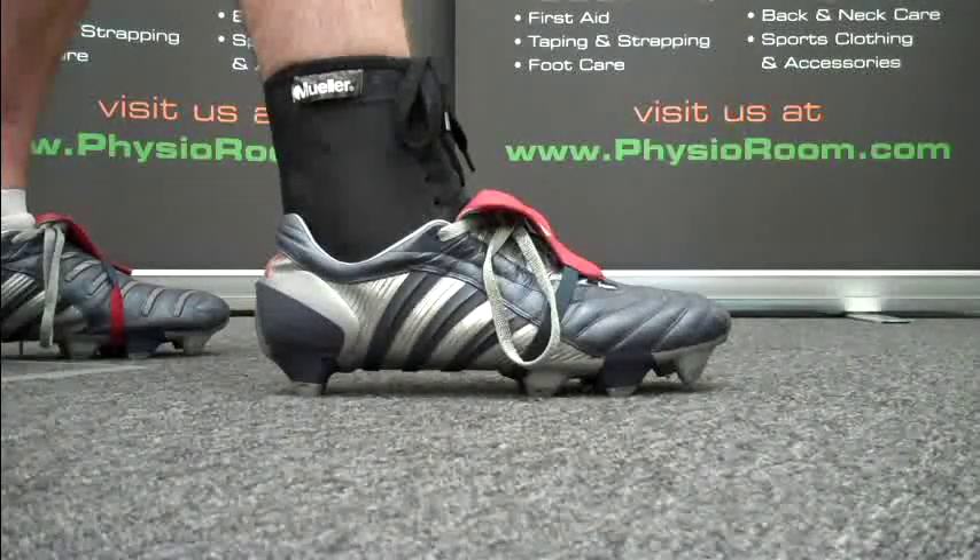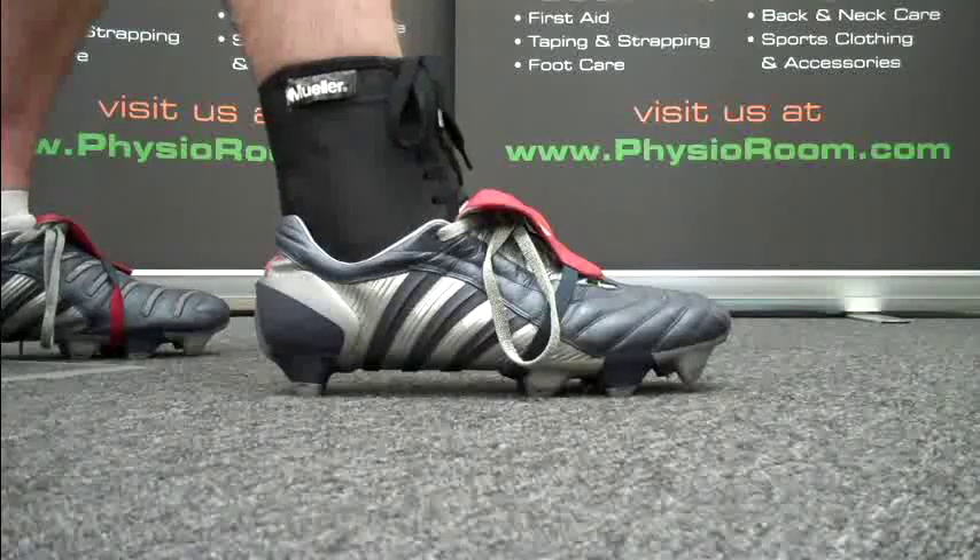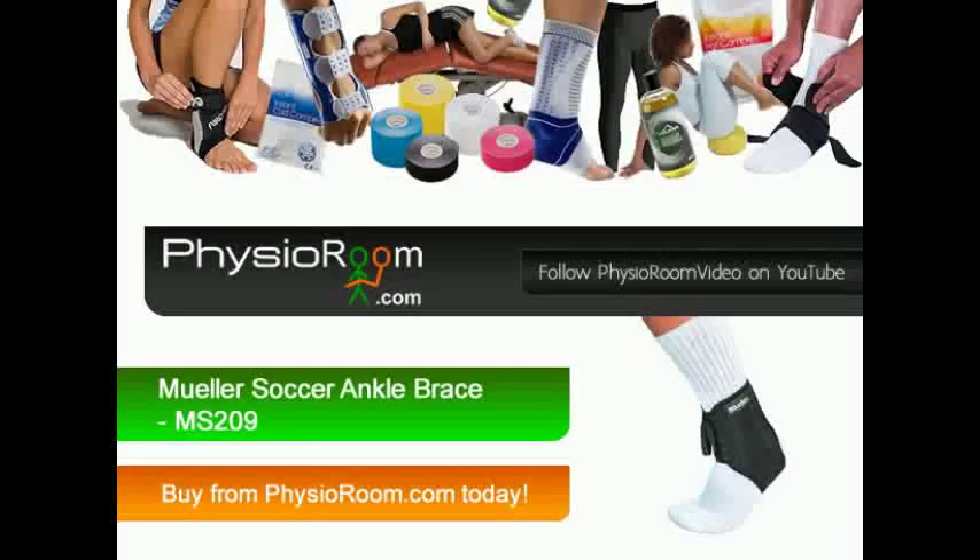The brace is available in all sizes and can be worn on either foot. So order your Mueller Soccer Ankle Brace from Physioroom.com today.